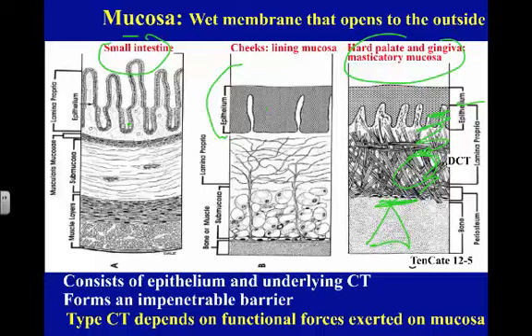And over the bone, you have periosteum. You see that? That's that denser connective tissue. That is outside bone. Please look at this. This is very, very important that we begin to understand that, and I'll explain that in a moment.